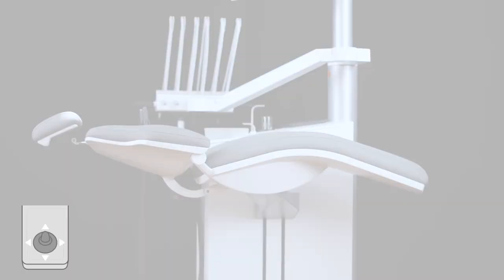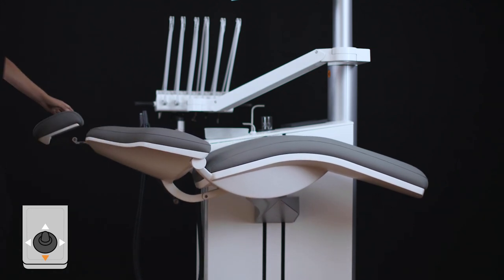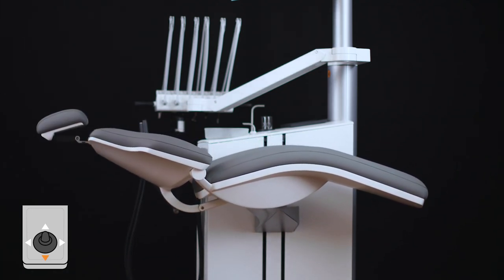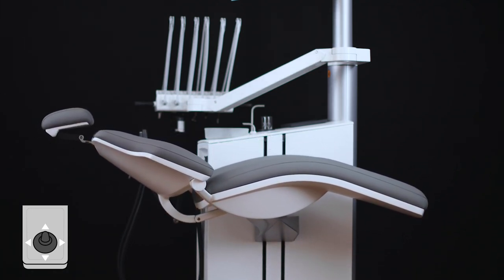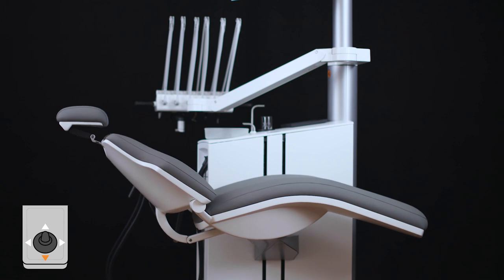When you move the joystick south, the chair moves to the entry position, the position used to enter the chair and for rinsing.